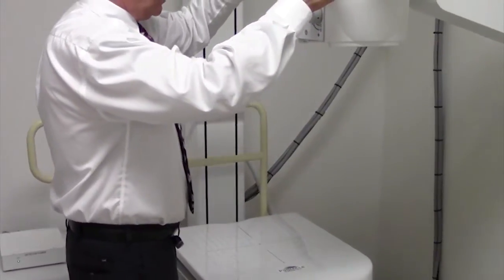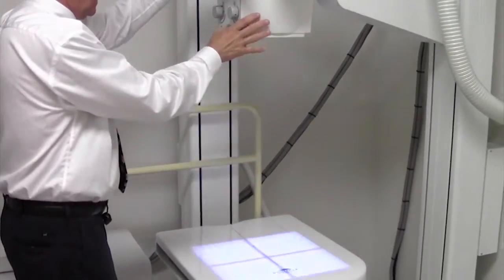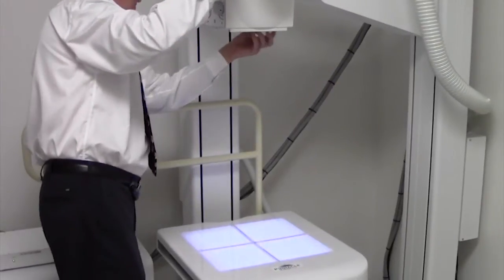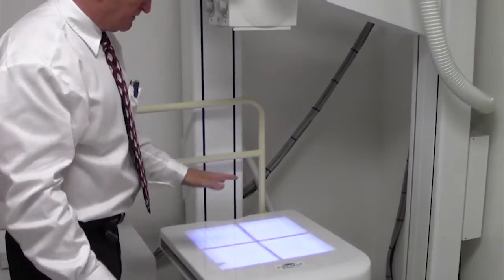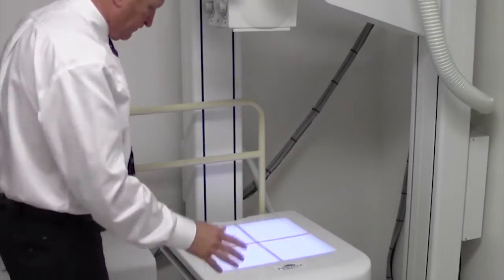Bring the tube stand over. Adjust it for the 40 inch FFD and you can do any upper extremity, lower extremity.